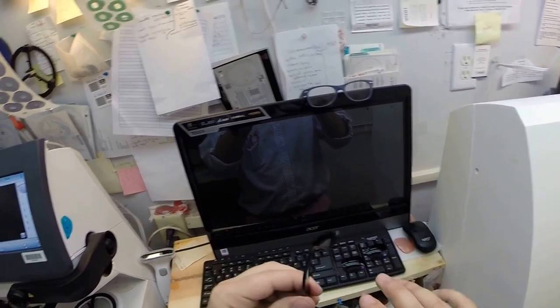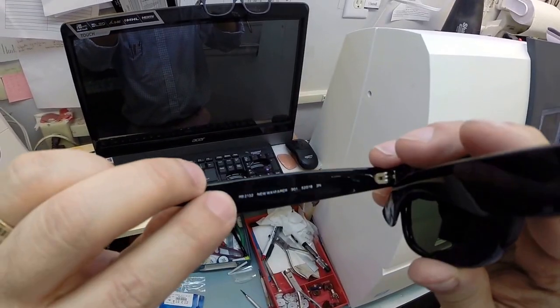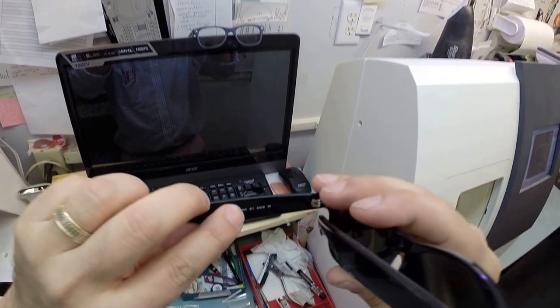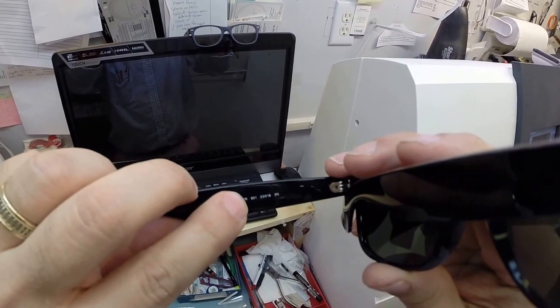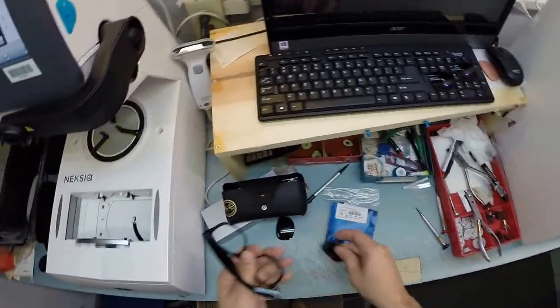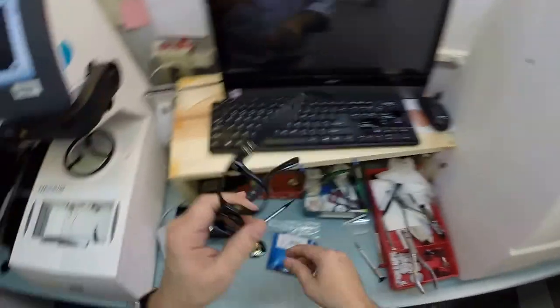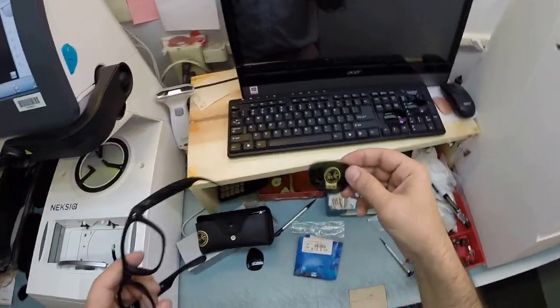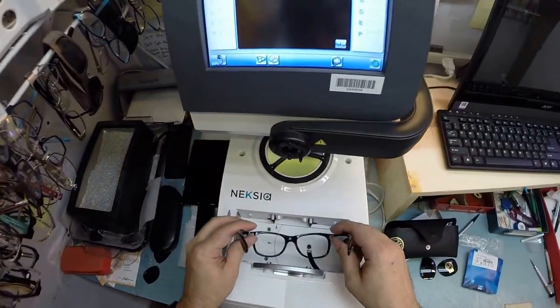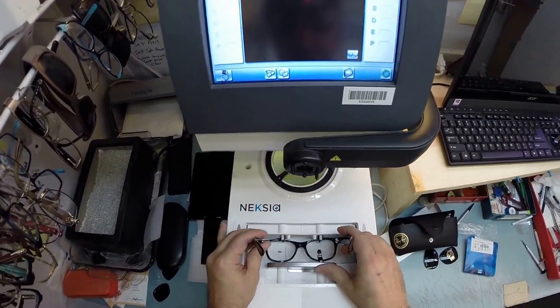Of course this is the 2132 New Wayfarer color 901 in the 52 eye size. I'm going to take out your original heavy glass lenses and cut some unbreakable bulletproof lenses to go into your frame.